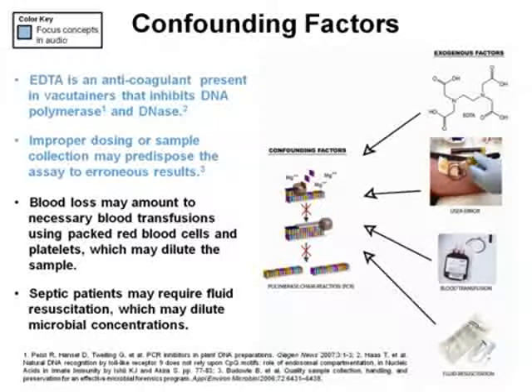The clinical significance of this inhibition is that EDTA is present in some vacutainers that are used for blood sample collection. The blood will be mixed with the EDTA in the vacutainer and will then be subject to testing by the nucleic acid recognition instrument.